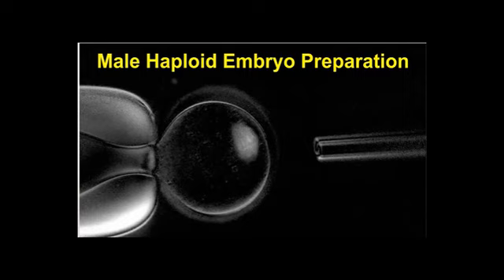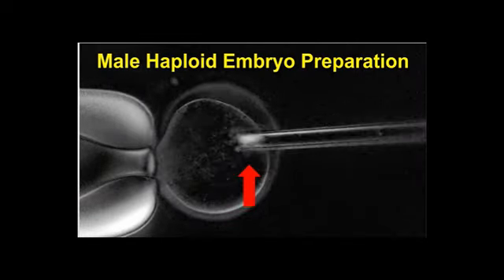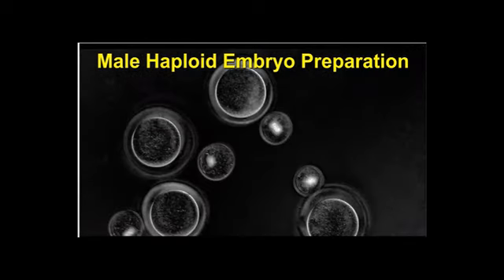This is how an oocyte looks under a polarized microscopy. The red arrow indicates the spindle complex. The spindle complex is then suctioned by the micropipette. And here are the resulting ooplasts inside their respective zona pellucida. As you can see, the karyoplasts containing the bright spindle complex are adjacent to the ooplast.